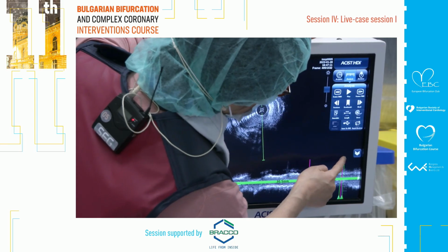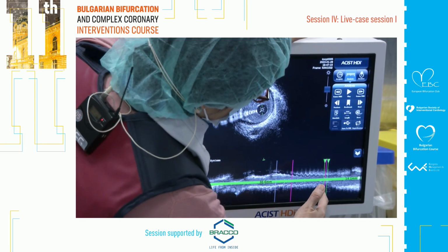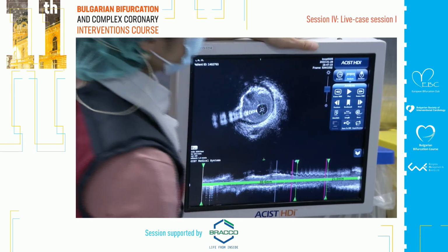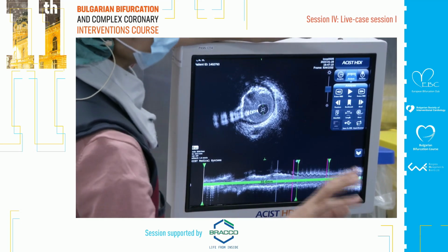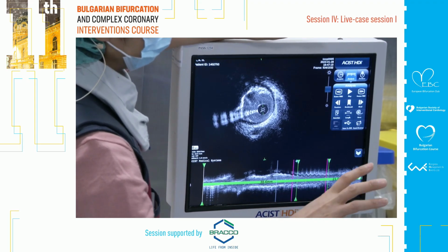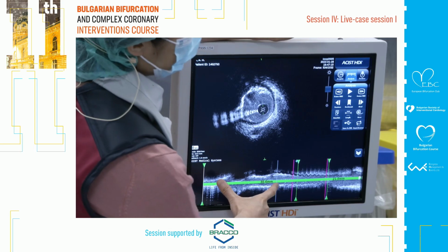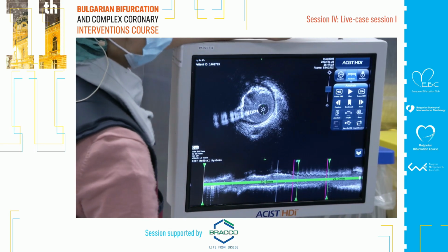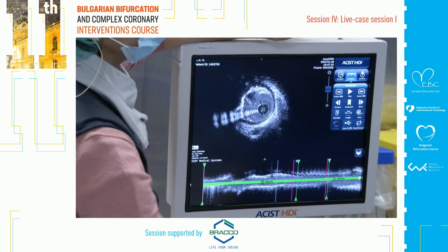So if you connect all together from the beginning to the proximal LAD, okay, what do you think? Looks like two separate regions, and also the vessel diameter is completely different. So using 3.0 only for the left main, and then concentrating distal, because your landing is distal to the trifurcation and the vessel is media to media 3.0, you have to use the 2.5 or 2.75. So what do you think?